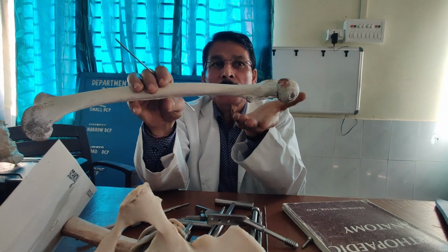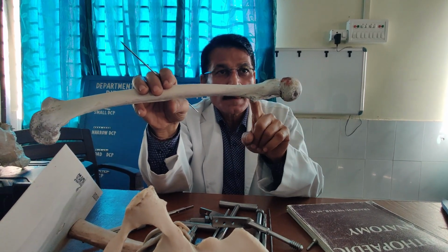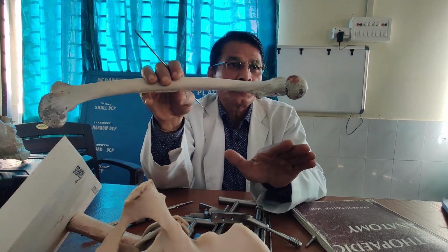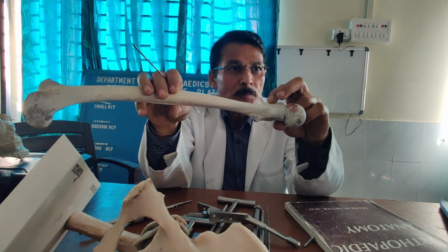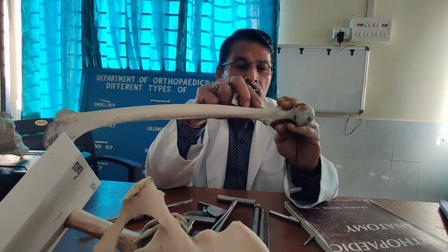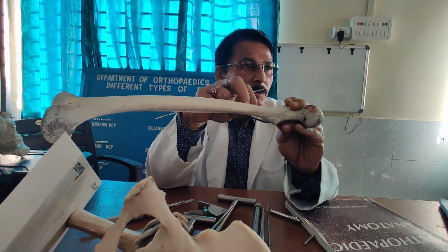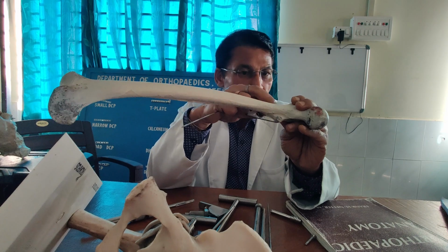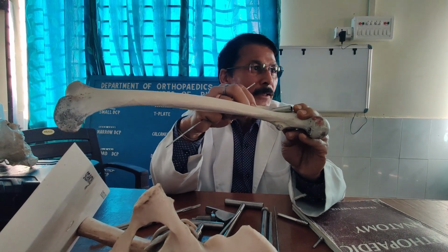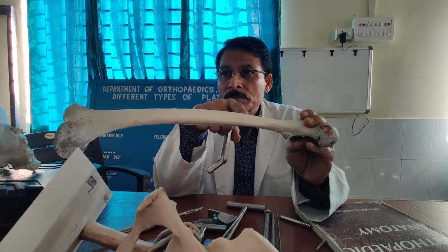Sometimes you may need a support there. The muscle is relaxed under anesthesia, and gravity will try to make an angle posteriorly. If you do not correct it, the plate will be offset like this. So essentially you try to bring the plate to the center. That is why the last screw is the first one to start.